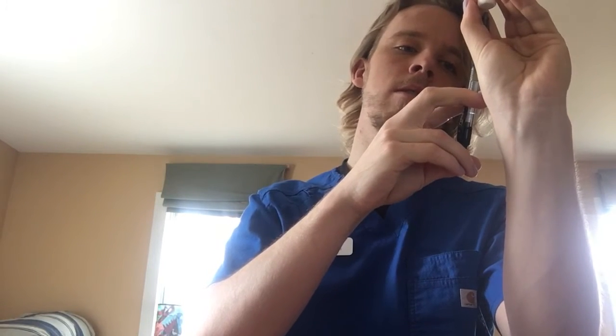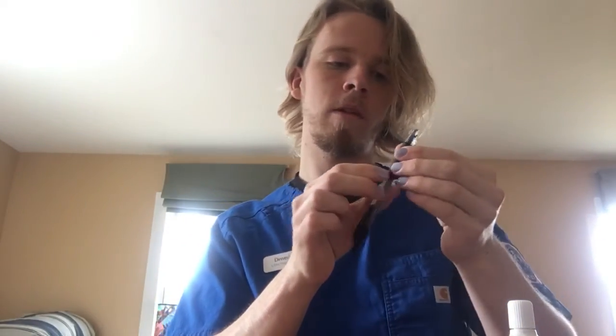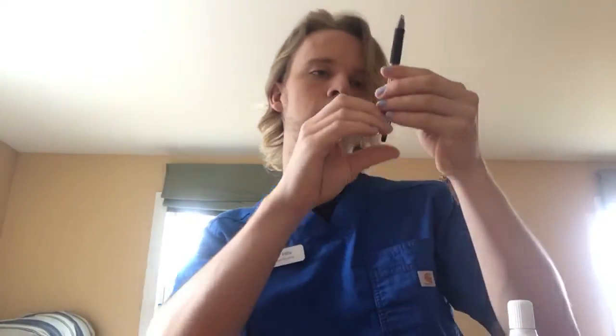I'm going to pull up about 9 units of just air. I'm going to put that right in the syringe, flip it up, and I'm going to inject the air, and then draw up 9 units of insulin and pull that out. I'm going to scoop the cap back on before I do anything else. I'm going to get the air out of there.